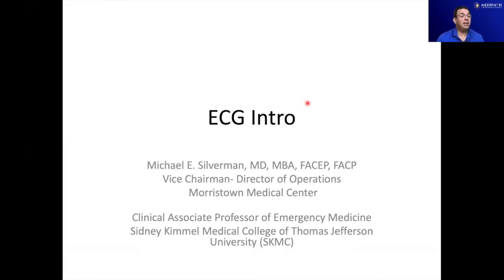So as she said, I'm Mike Silverman. I'll be lecturing today on EKGs. This is an intro. When I do EKGs for our residents, it is 6+ hours of lecture. So realistically, that's not something we can do today. What I'm going to do is give the basics and add some potpourri of different things we look out for, some of the more common stuff and how we look out for it. Please let me know or stop us if I'm going too fast or there's any trouble with the lecture.